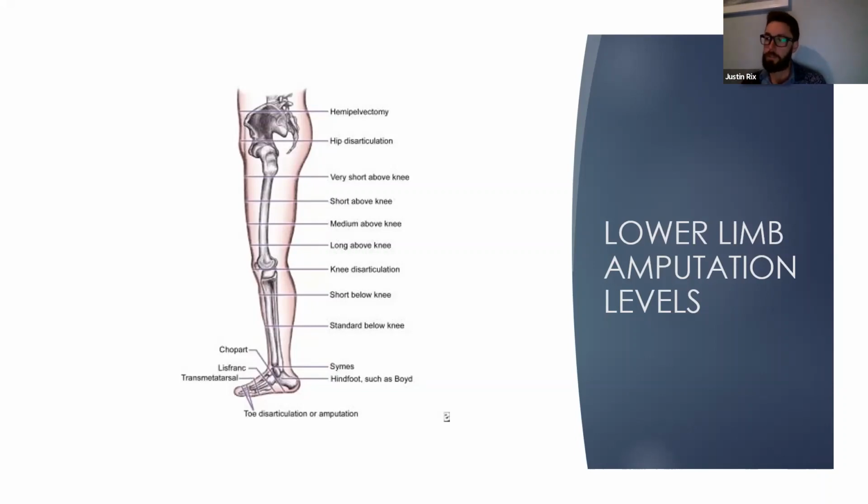For an AK amputation, the longer was generally considered better, and for a below-knee amputation, we were always taught and told about surgeons using a 4-finger roll, 4 fingers below the tibial tuberosity, and this is obviously not always the case. As a prosthetist, we want a stump that is long enough that we can comfortably fit a socket with, but not too long that we have issues with the components fitting in the space between the bottom of the stump and the ground.